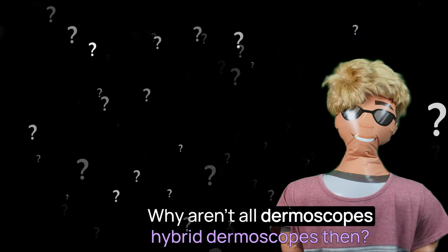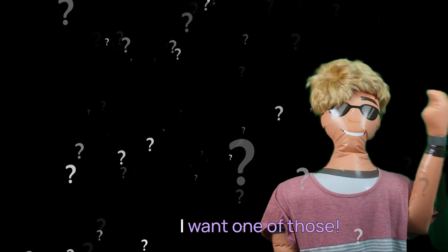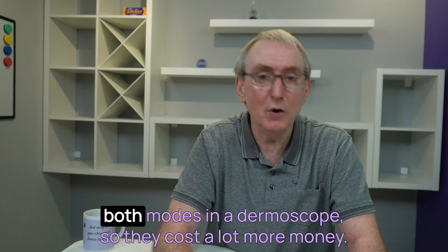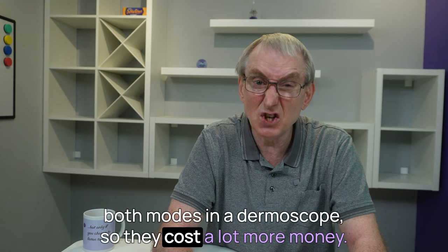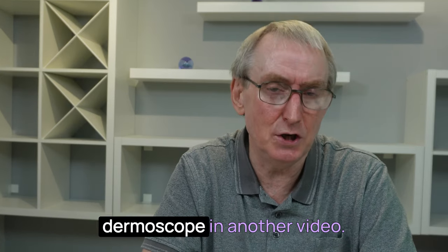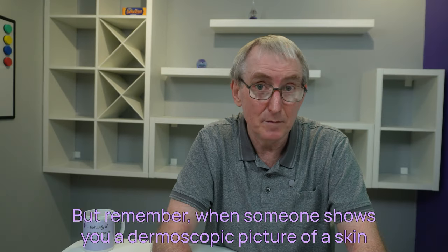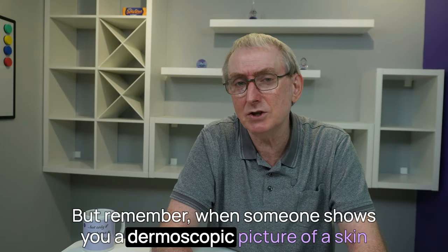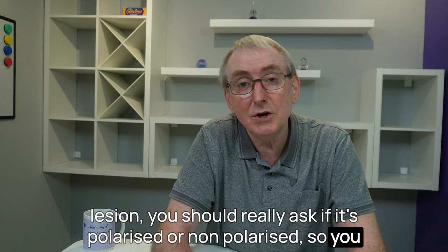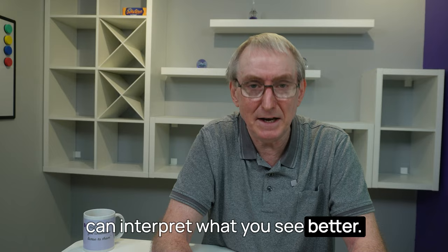Why aren't all dermoscopes hybrid dermoscopes then? I want one of those! For the simple reason, Dave, it's more complex to include both modes in a dermoscope, so they cost a lot more money. I'll be giving advice on the questions to ask before you purchase a dermoscope in another video. But remember, when someone shows you a dermoscopic picture of a skin lesion, you should really ask if it's polarised or non-polarised so you can interpret what you see better.